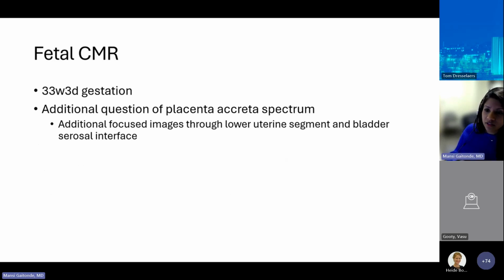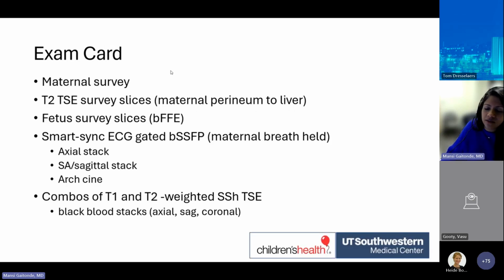Interestingly, a few days before the scan, when we'd already gotten it approved by insurance and set up, the MFM reached out to us and said, we're worried about the placenta accreta spectrum, and maybe we need to do more of a focused body fetal MRI. But we worked with our radiologists, who are very experienced in imaging the placenta, and we were able to make sure we got the right sequences at the time of our cardiac scan. So there were 2 important questions in addition to the cardiac findings, including imaging the placenta. And I think we can be proud of the fact that we got through it all, considering how challenging this scan was.